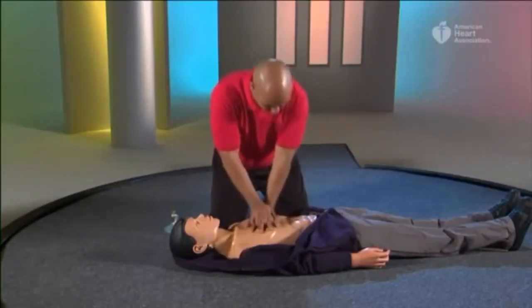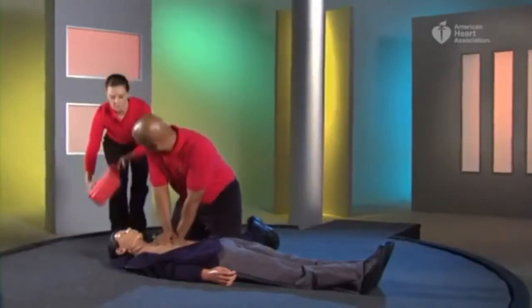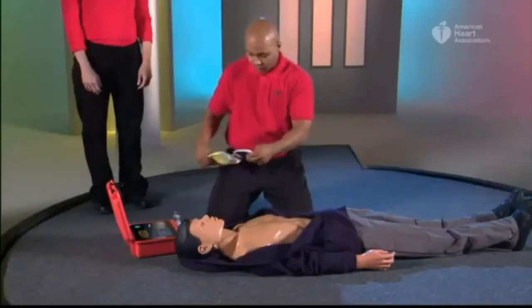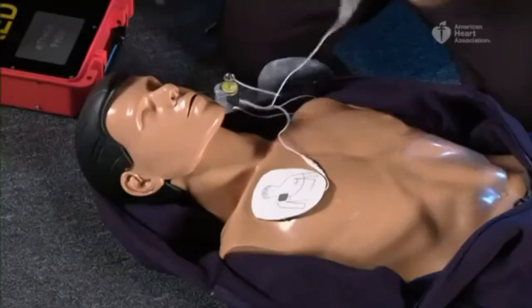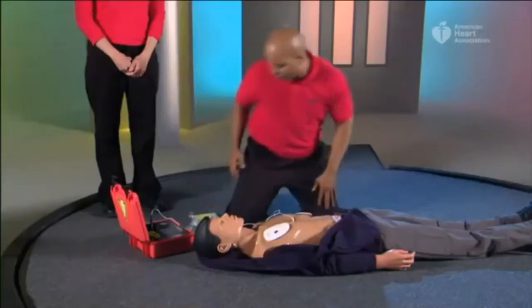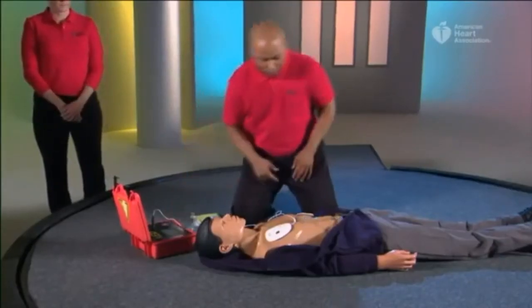Continue CPR until the AED arrives. Turn the AED on by pushing the on button or opening the lid, then attach the pads to the victim's bare chest. The AED will guide you through the rest of the steps. Follow the AED prompts and the pictures on the package or pads. The AED will analyze the heart rhythm, charge if a shock is needed, prompt everyone to stay clear, and deliver the shock.